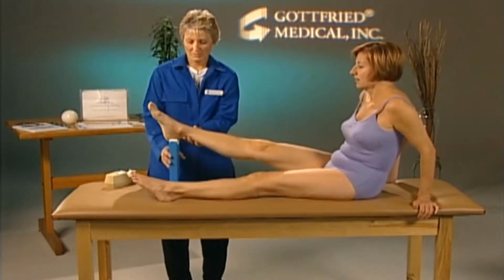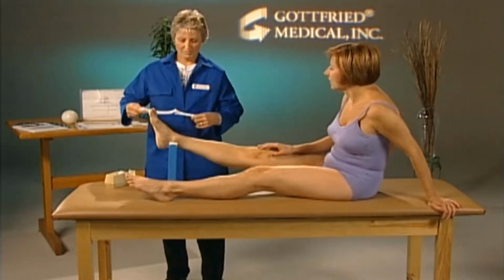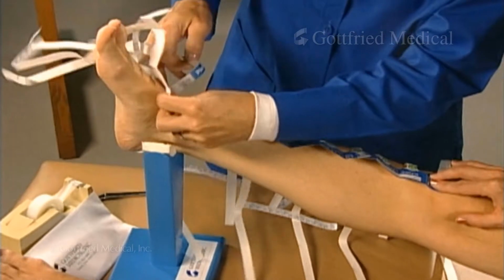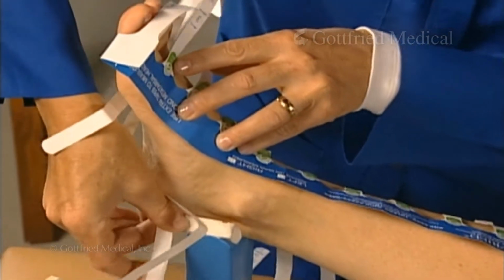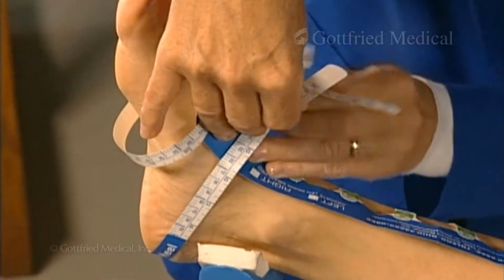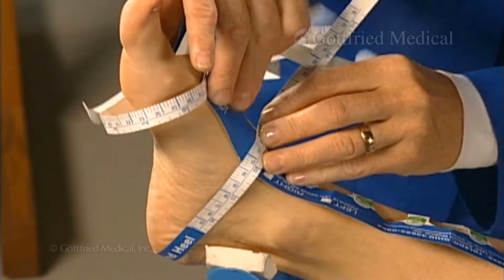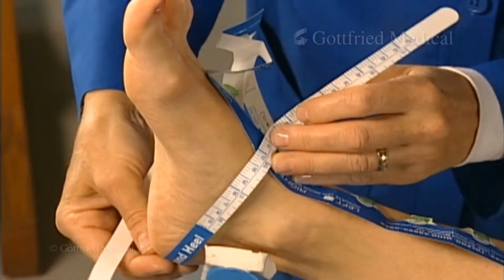Have the patient or customer lie face up with the leg slightly elevated and the foot at a 90-degree angle. On the knee length tape, find the 0 strap. Place the spine of the tape at the bend of the instep and wrap the 0 strap around the highest point of the heel. Fasten it securely with the adhesive pull tabs and reinforce with transparent tape.